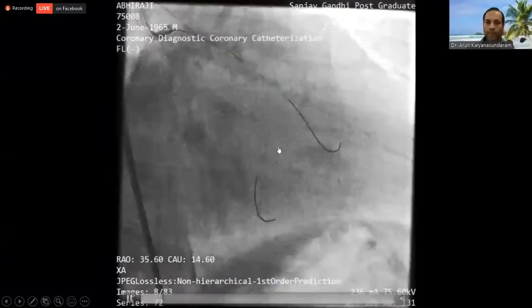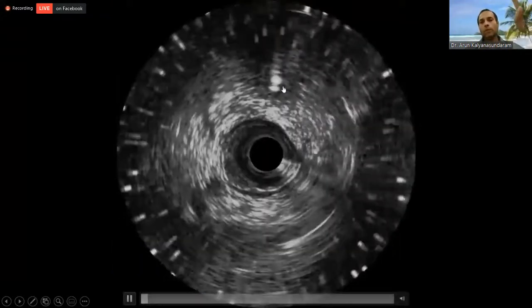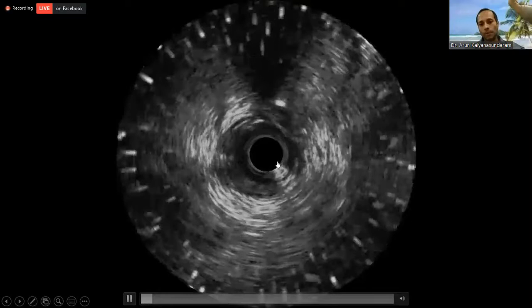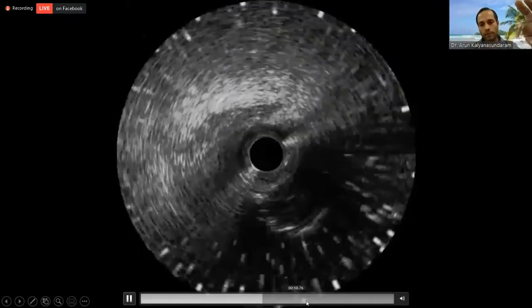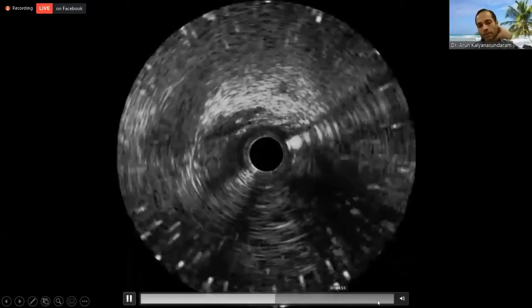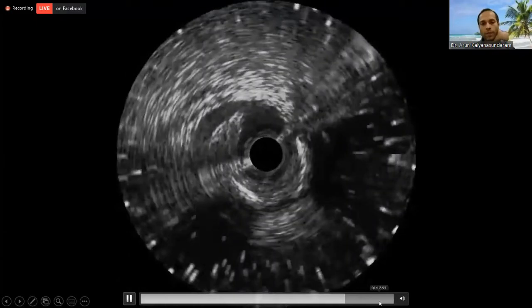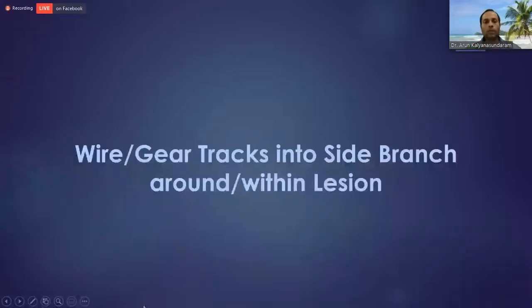Put in the dual lumen catheter, wire the second branch. Confirm with IVUS at 12 to 1 o'clock. You can see that you're in the true lumen. Here again, you're in the true lumen. Further down, you'll see you were false. That's false lumen. You can see the compressed true lumen around 6 o'clock. And more proximally, we have a true lumen again. So this ended up being true, false, true. But again, got both branches.